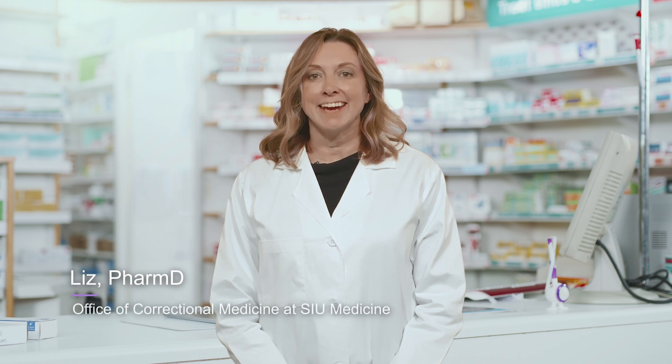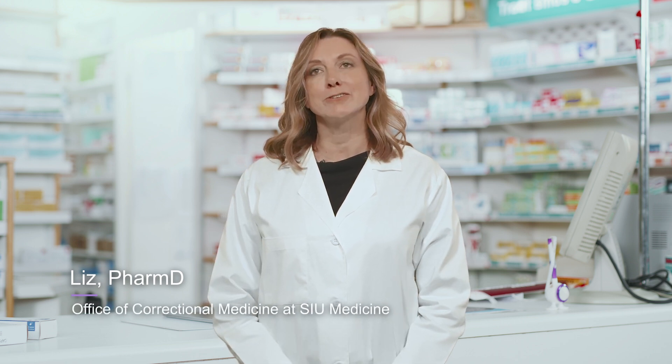Hi, I'm Liz. Today I will show you the proper technique for using a GLP-1 injector.